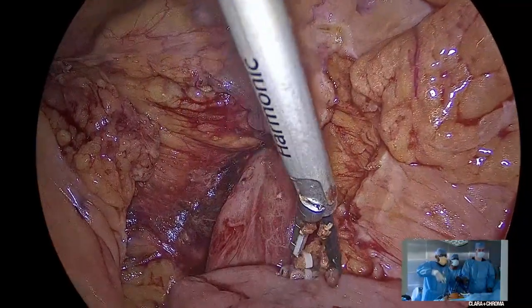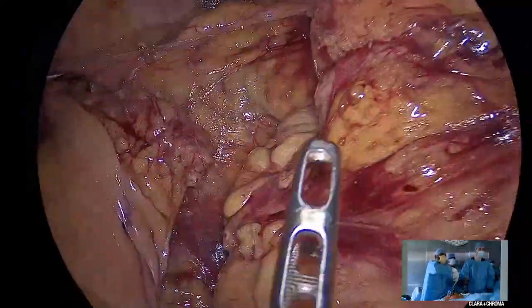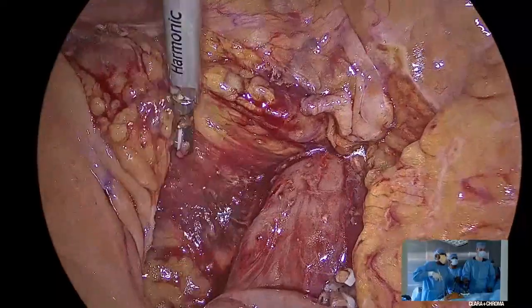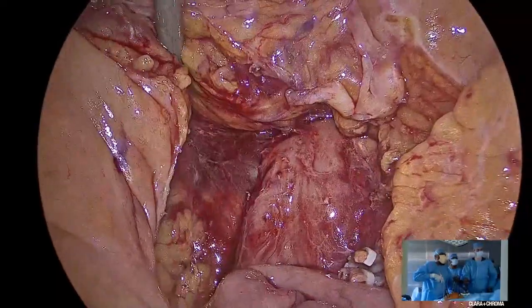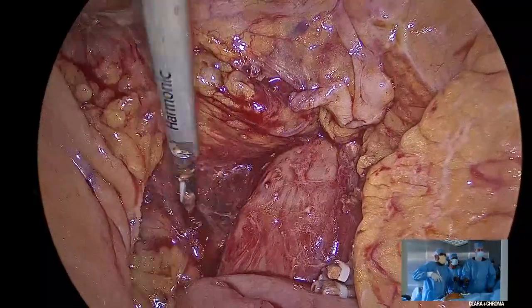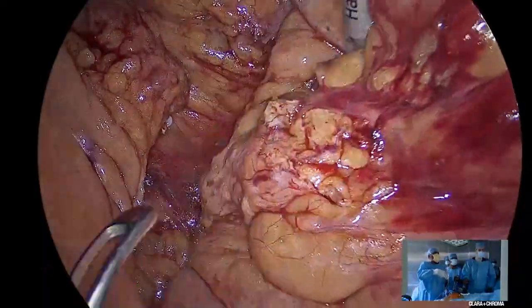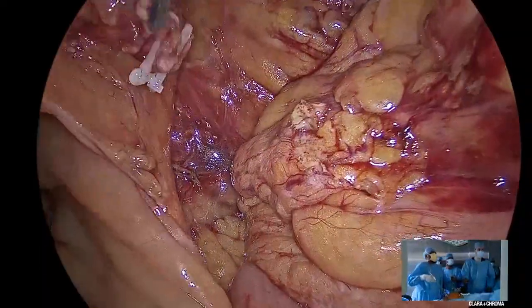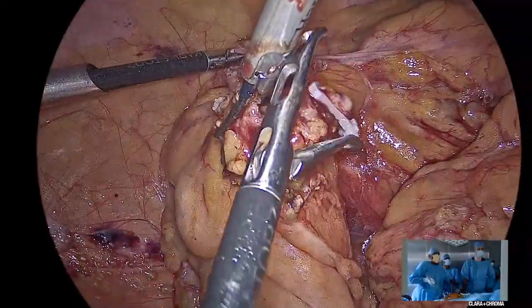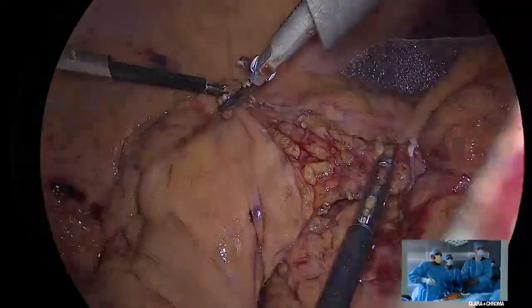And we've got the ileocolic pedicle over here, second part of the duodenum. And these are the two different embryonic planes. If you look at them, that's the embryonic plane that belongs to the colon. And that's the embryonic plane that belongs to the retroperitoneum, which we are supposed to nicely differentiate during a complete mesocolic excision. And then, of course, not to forget the most important part of any oncological surgery, getting the high tie.